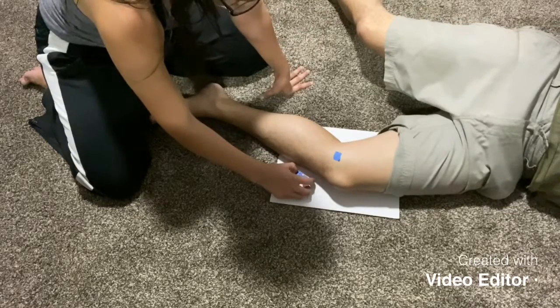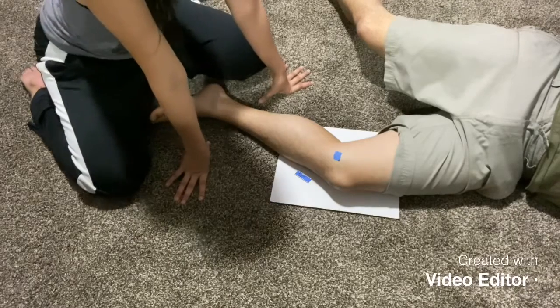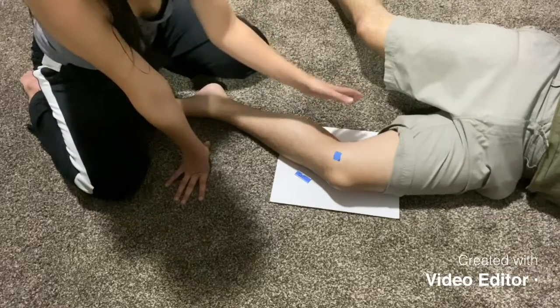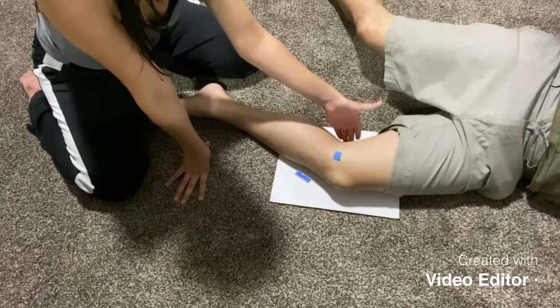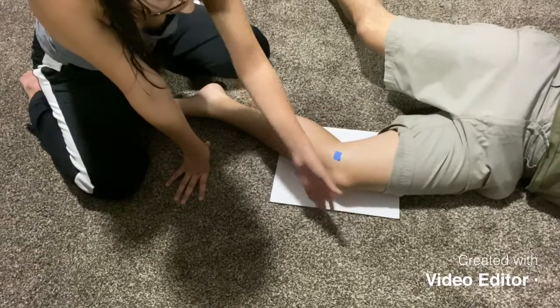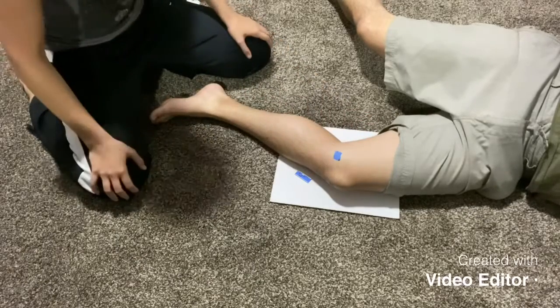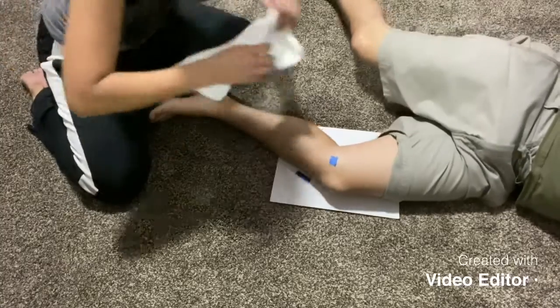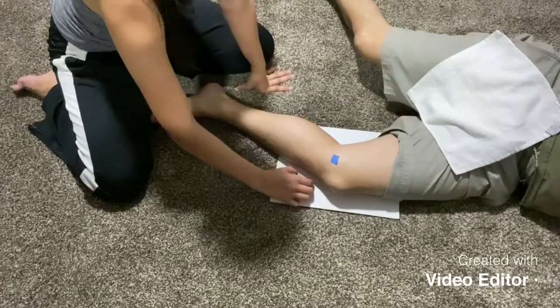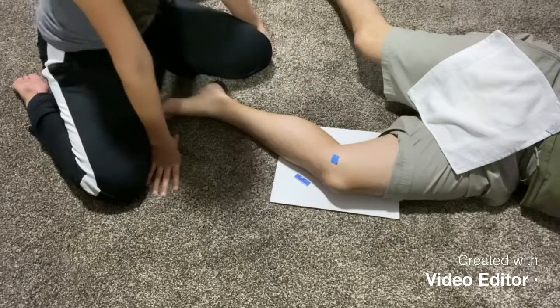Marking for the left side, and the collimation on this one is going to be 8 by 10 inches, and then we'll bring it in to 1 inch posterior and anterior to the patella and the posterior shadow. Shielding for the gonads, markers placed, and click for our lateral knee.